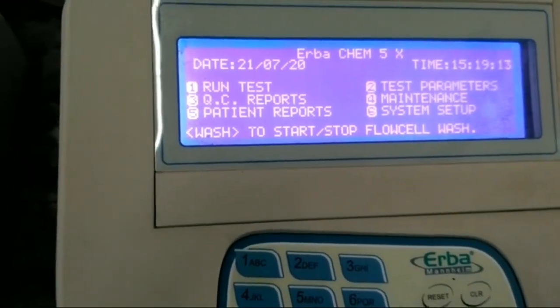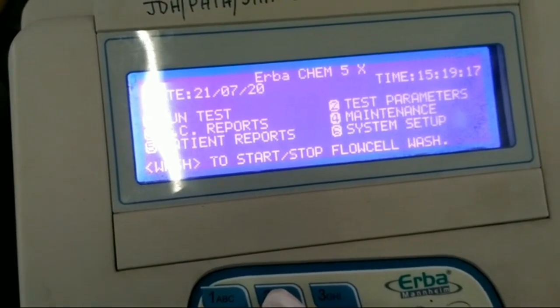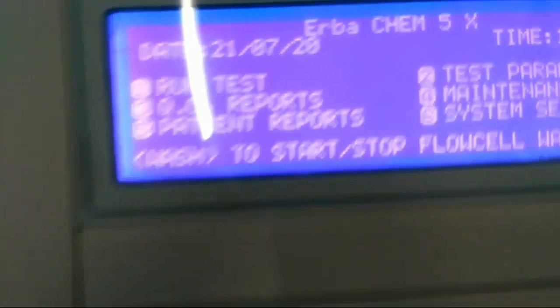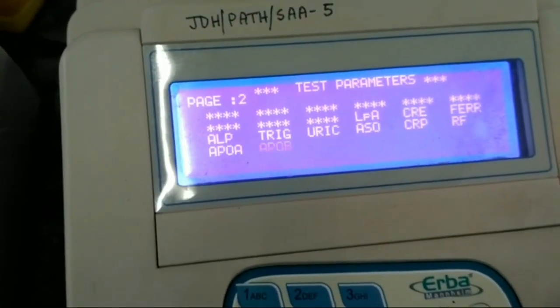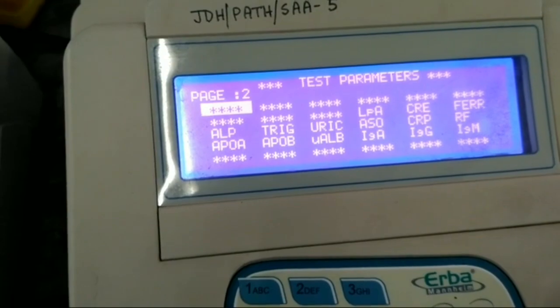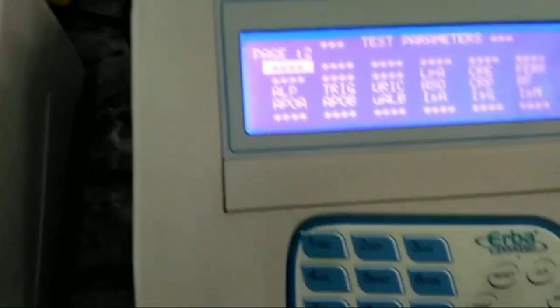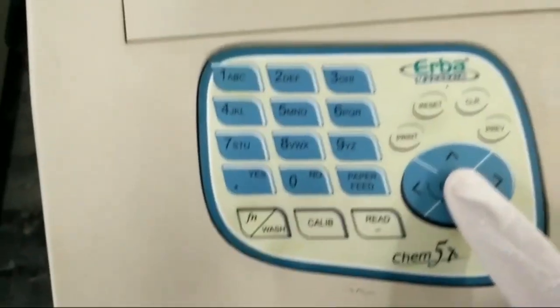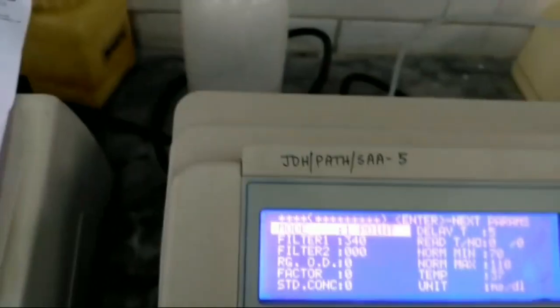In your machine, we have to press number two — that means the test and parameter number two switch. After pressing the switch, you have to go to any blank space. Suppose this is a blank entry — you have to press enter.